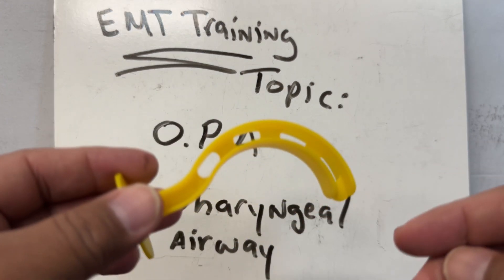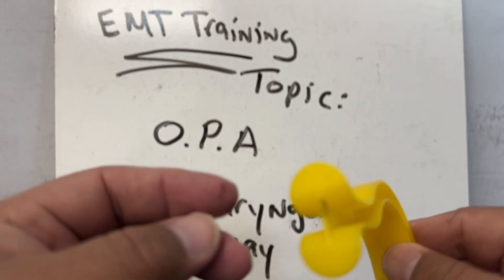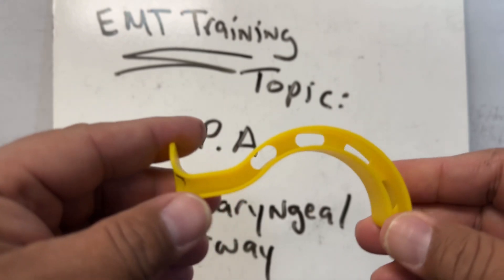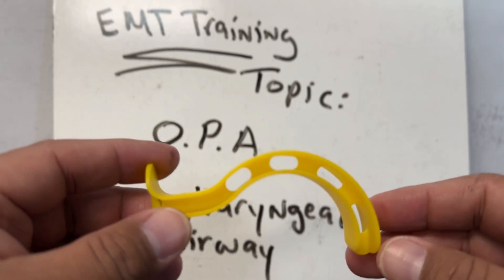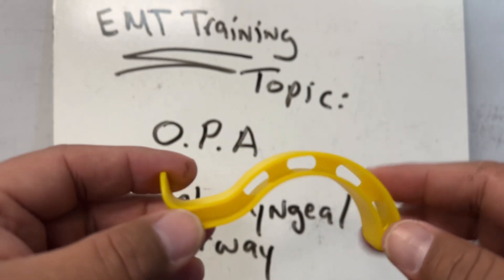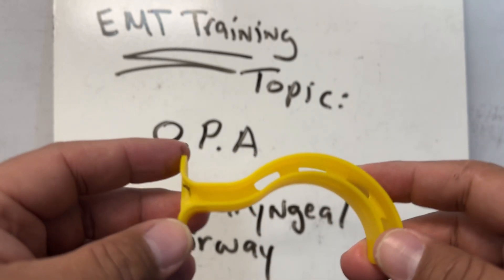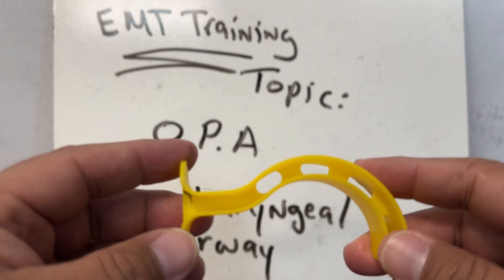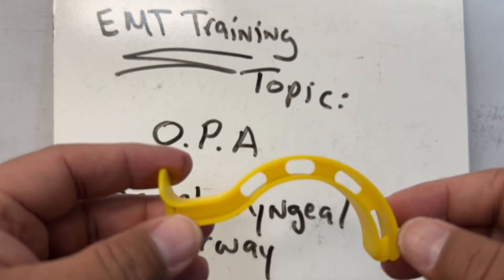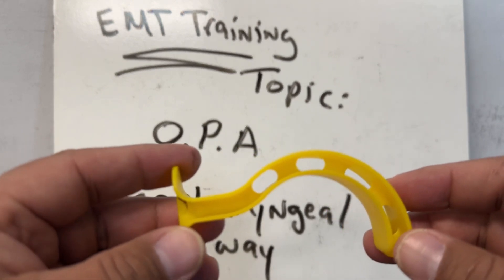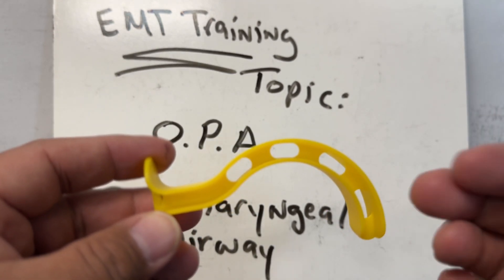Here is one type of OPA. Notice the curvature — we'll talk about the different parts. This curvature is where the tongue is located, allowing it to be moved.